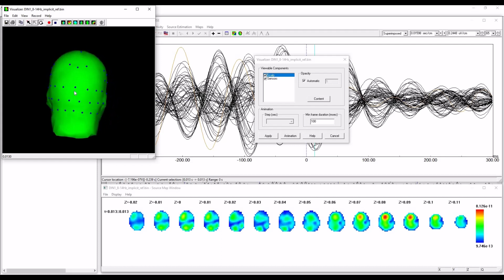But I think this is explaining why when we use a common average reference, we're actually subtracting out, for the very reason that you made a dense sampling back for cerebellum here, the common average is not the way to go. So we could discuss that later.